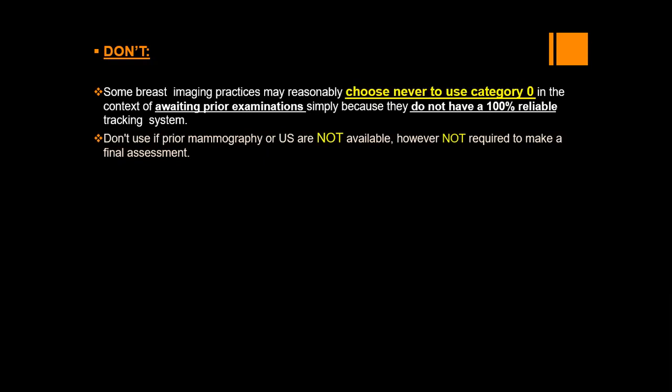Don't use category 0 if the previous mammography or ultrasound images are not available and not required to make the final assessment. You can judge and give the final assessment before you find the previous one. So no need to use BIRADS 0.